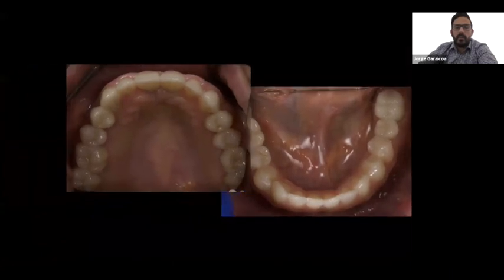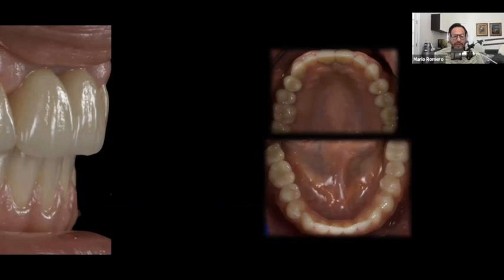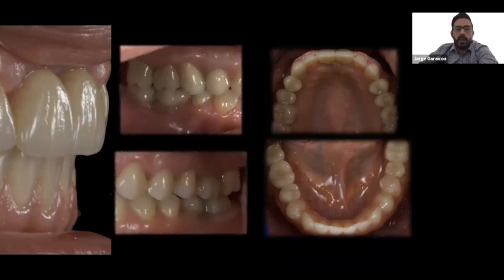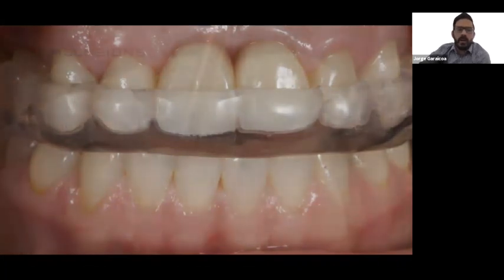Those are the side pictures. Here are the occlusal views of the restorations and how she was. She was very happy with the end result. Beautiful restorations, beautiful ceramic, and a very well-planned case as well. Yes, this was done by Bill Moraes, a fantastic lab technician here in the Portland area. This is what we have about 3 years after we finished that case, and we finished with an occlusal guard.